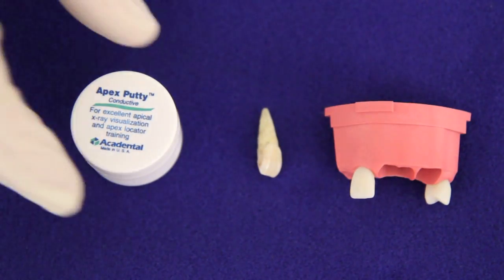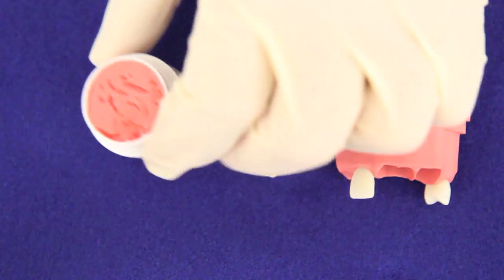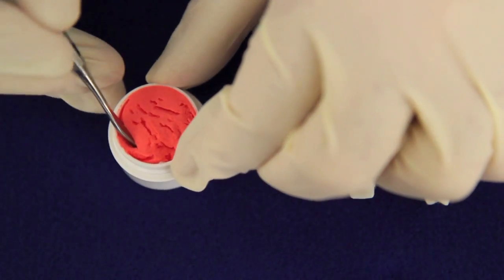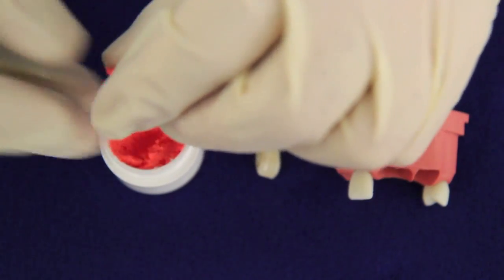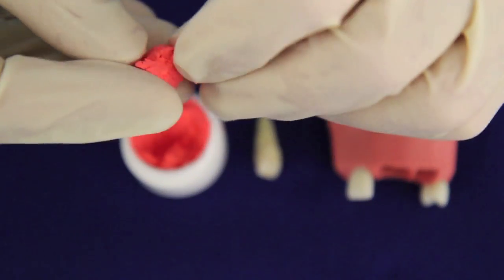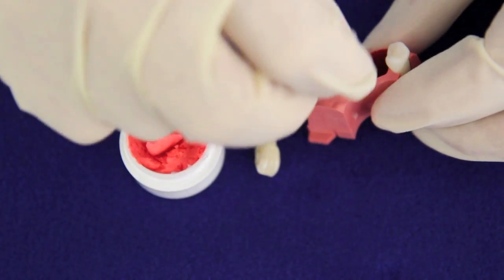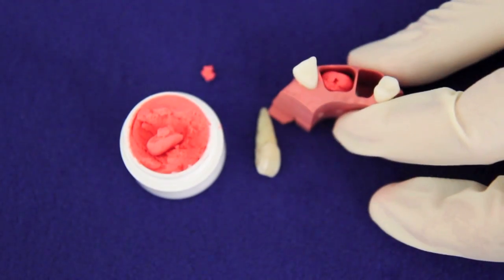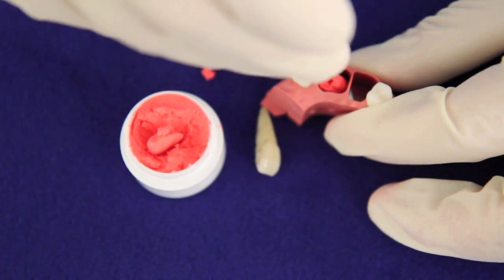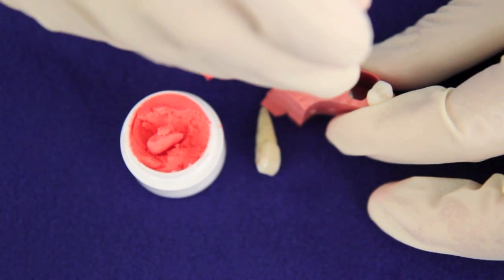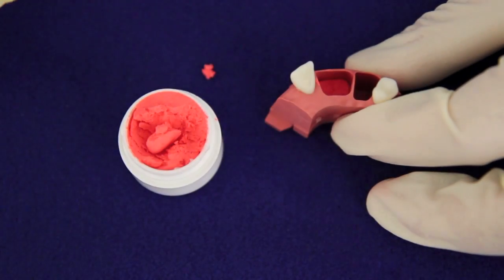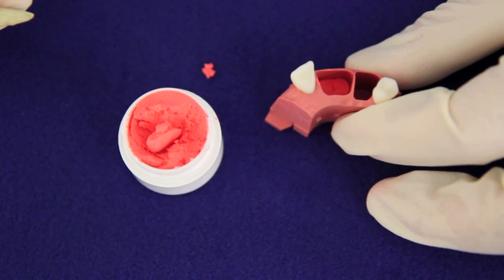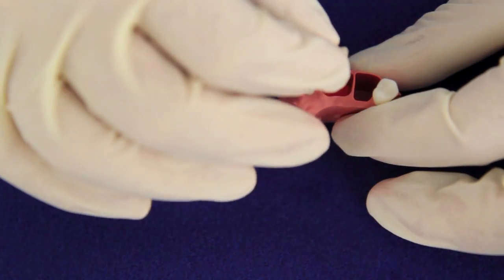Now we're going to make a ball of apex putty. Now I'm going to tap it in place to the bottom of the slot with the end of a mirror handle. My aim is to have the bottom three millimeters of the root embedded in the apex putty.